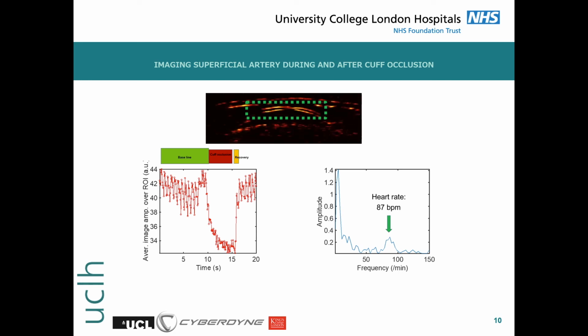It should be noted that whilst visually blood flow ceases, oxygenated blood should still be present in the vessel, and this is not seen on the photoacoustic image. This may be a function of aggregation of the red blood cells, leading to a change in the absorption coefficient of the oxygenated blood in stasis. If this technique were to provide additional information in low flow states to colour flow Doppler, then this would need to be overcome.